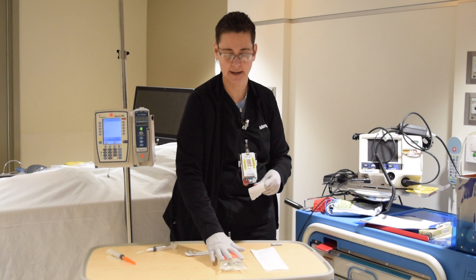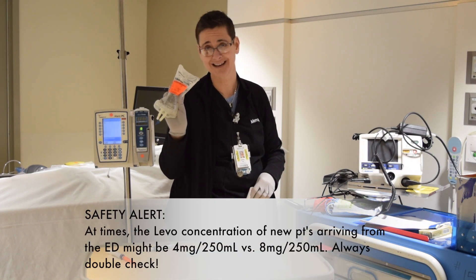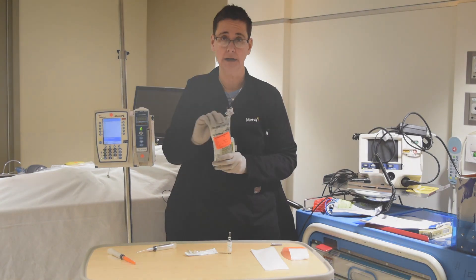We are going to add a medication label — go ahead and put whatever medication this is, you're going to want to date it, and you want to put the concentration on it. Now remember, Levophed is only given through a central line.